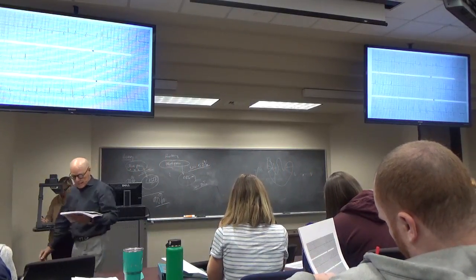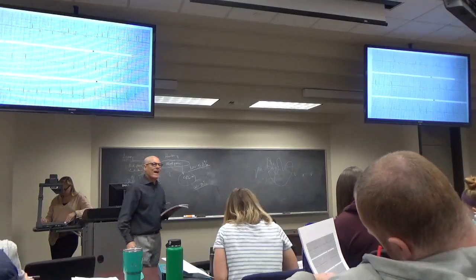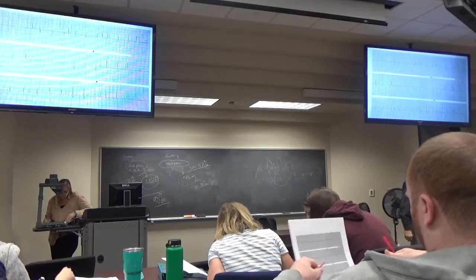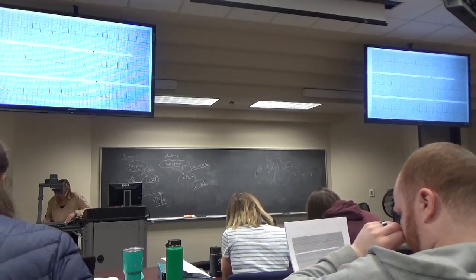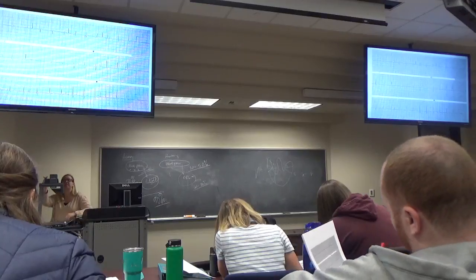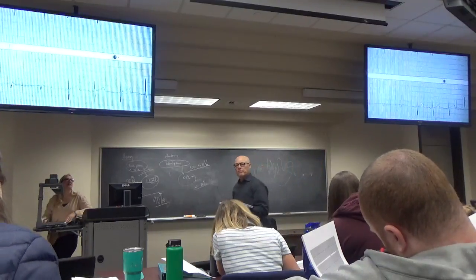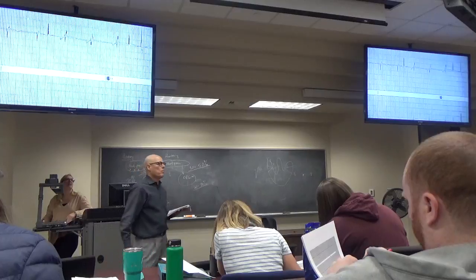Oh my gosh. Now look at the P wave. Look at the P wave in V1. What did you think of that? What P wave? No inversion? Inverting. Yeah, it's weird. It's the weirdest P wave in V1 you've ever seen up to this point. That weird looking P wave in V1 probably explains the rabbit ears in V1.